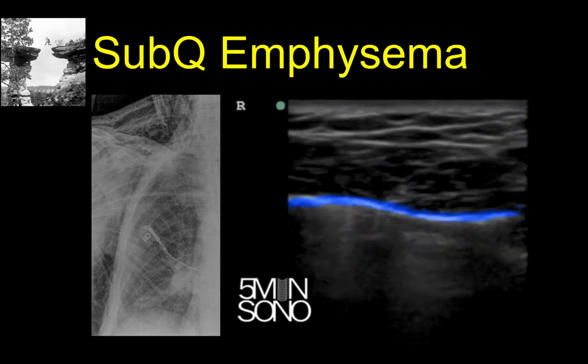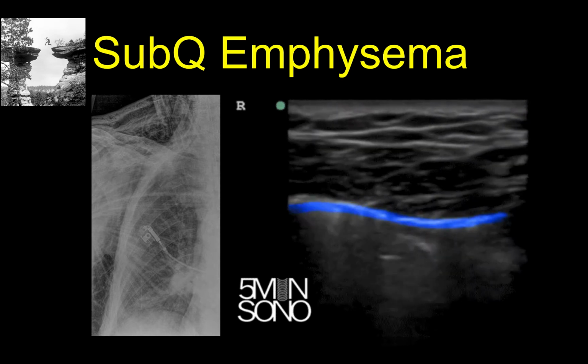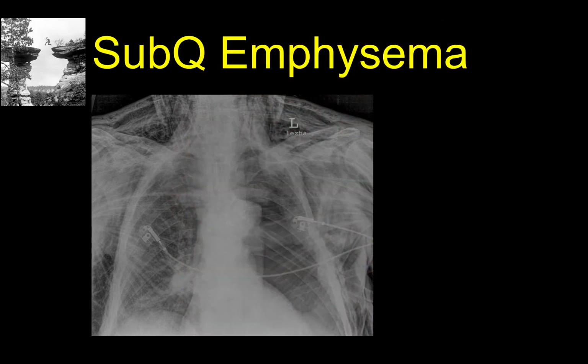This is one reason it's so important to start with the sagittal orientation in order to make sure that the rib is in your field of view and what you think is pleura actually lies below the ribs in the appropriate space. Unfortunately, this will make ultrasound completely useless. Though the good news is that if this person is unstable, they will very often need a chest tube since they are very likely to have a pneumothorax and you can detect subcutaneous emphysema clinically.